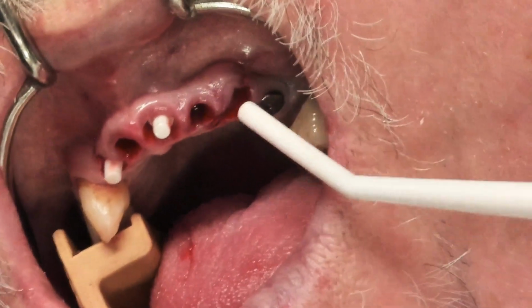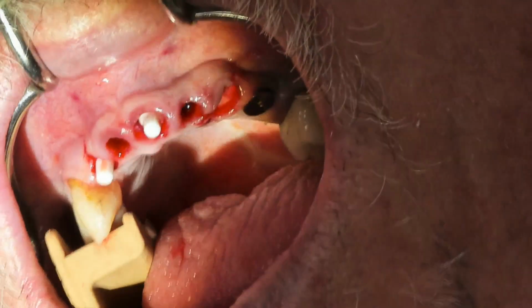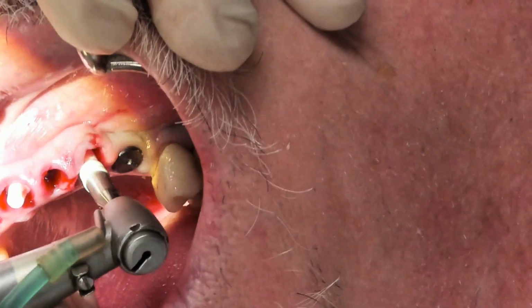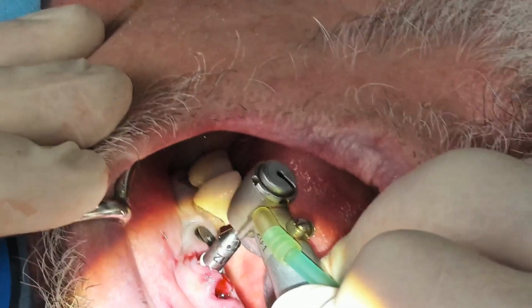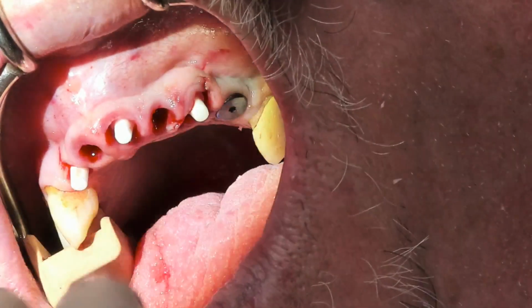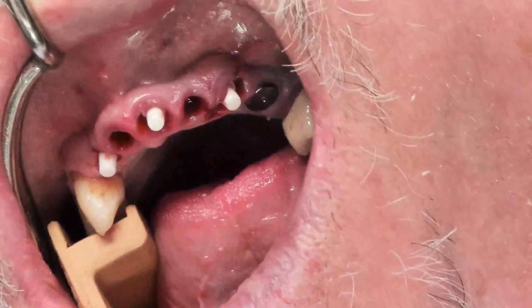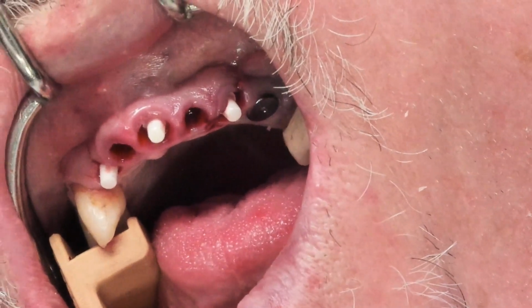Okay, same thing here, 45 Newton centimeters. I have the hardest time doing that, so I do it this way. So now I can already tell I'm going to have to take a little bit of the facial of this one off. No problem, because it's one piece. We're going to prep it. Z-Systems is, I'm sure, Dr. LeConte. Hi, Billy. Who's helping out as the proctor in the hotel. We'll talk about why this is preppable, where some of the other zirconia implants are not.